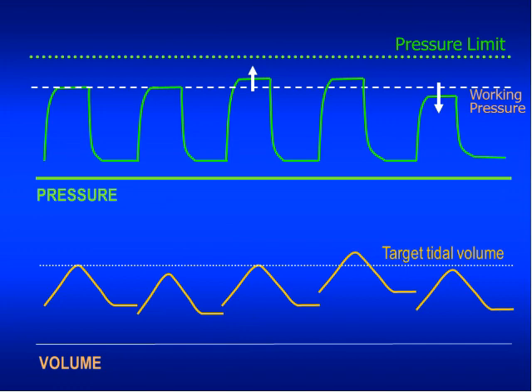For those who may not be totally familiar with it, let me explain it. This is very interesting. The slide, somehow the lines migrated here. They used to be nicely joined. Something happened in translation, so use your imagination and line them up here. Anyway, in the upper panel, you can see in green the pressure limit. You can see the pressure waveform.